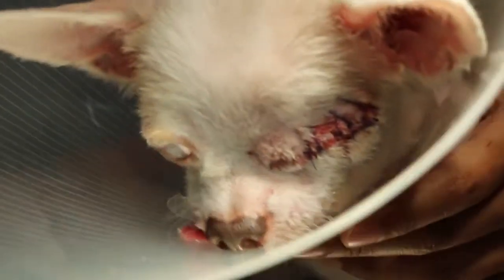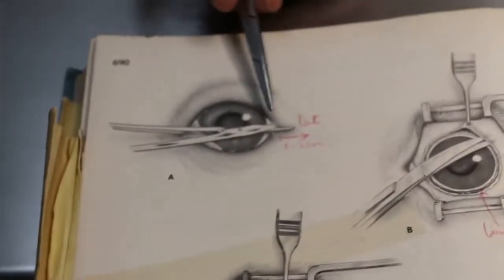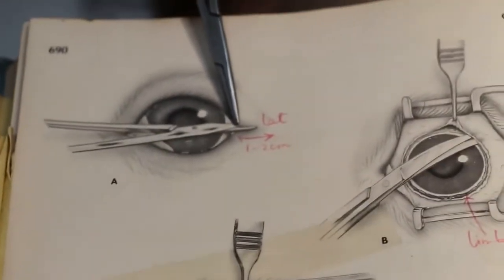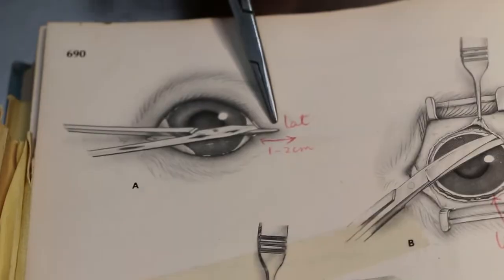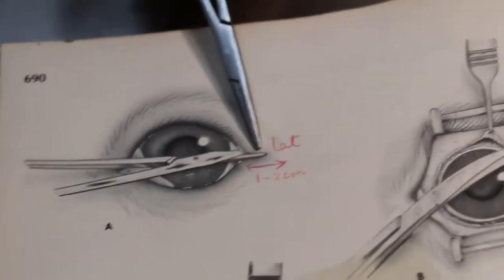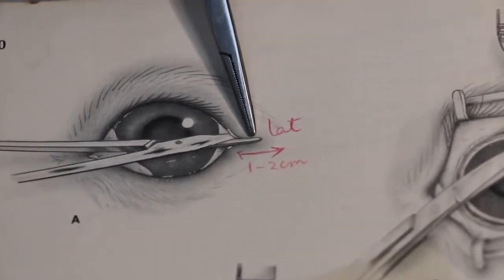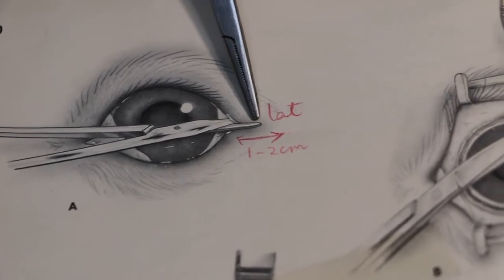Show the eye. The eye is stitched up already now. Okay, so I will go through the surgical procedure. We start with the first part, which is the lateral canthus. So first I will cut the lateral canthus under general anesthetic. Cut about 2 cm. Then there was bleeding, so I will clamp the bleeder so that there is no blood all over the place. Okay, so clamp it.